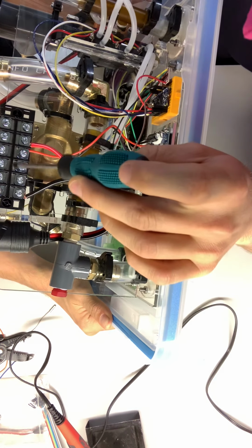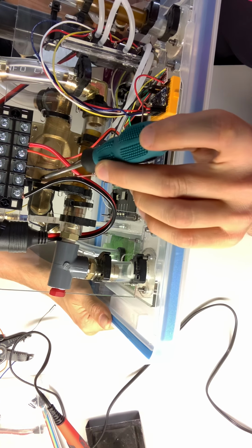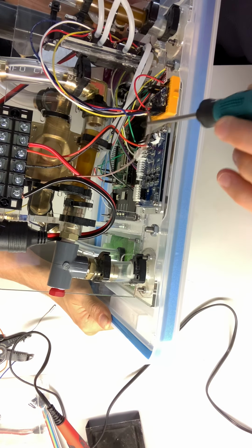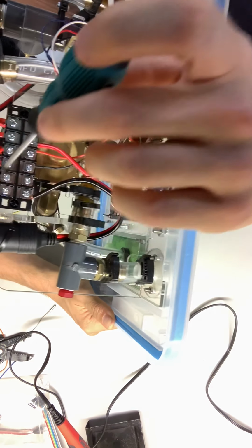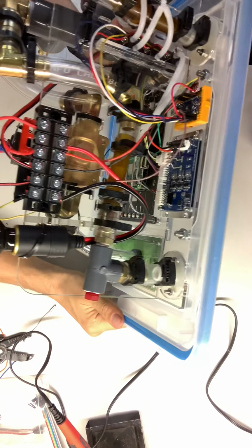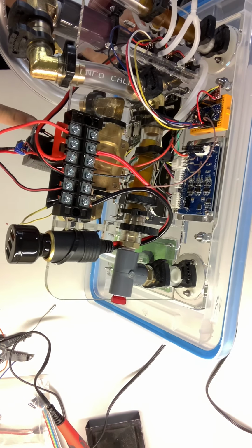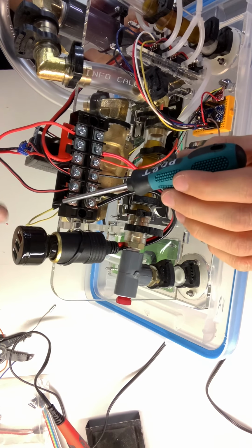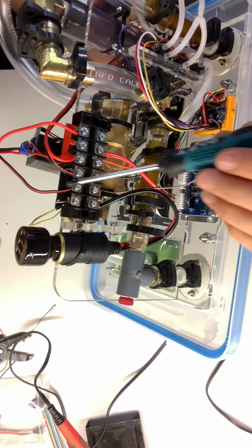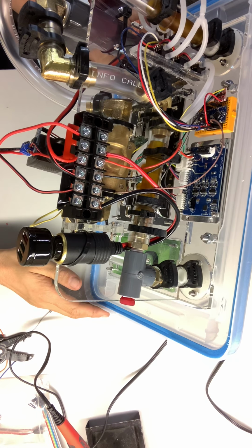Fan driver. Let's just make sure everything's on the right side. We have these grounds. This is a ground going to the Arduino, and this yellow ground is going to the solenoid, right? It's just to declutter that. Is it the power? No, it's the signal. This is the signal ground. Okay, that's fine, because there's a decent bit of current in there.